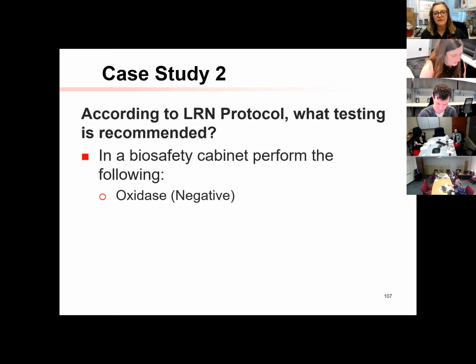Burkholderia mallei is iffy and usually is negative. And it's an organism we don't see here in the United States. So just being in the United States, I take that into account that probably is not that organism either. So I know it's oxidase negative. And then if you go to the one that we know is oxidase negative, which is our Francisella.